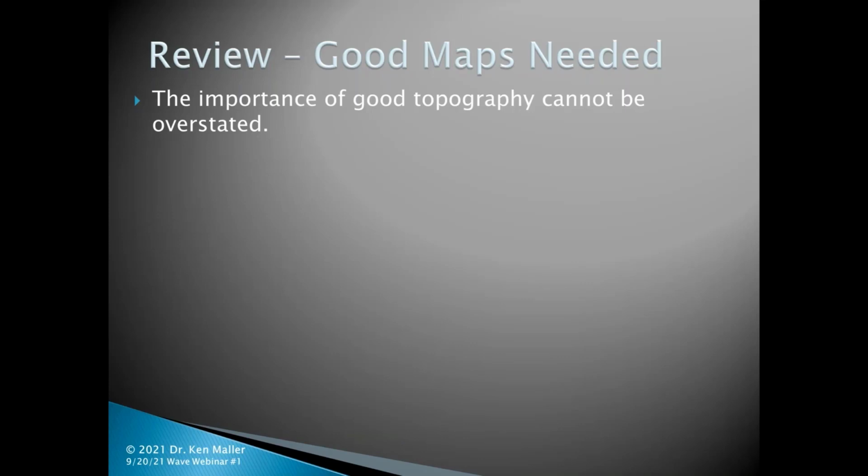If you're not there to hear the response from the patient, you have a little bit tougher decision making. Does the patient really need the extra quarter diopter of minus? Well, in much the same way, if you're removed from the topography captures, you have a tougher time understanding the trustworthiness of the maps and whether or not they really are good for design.